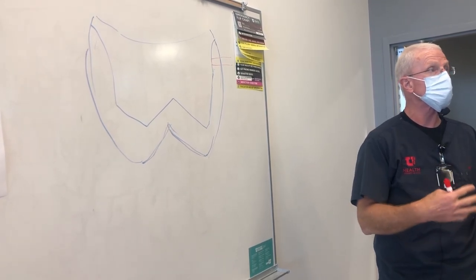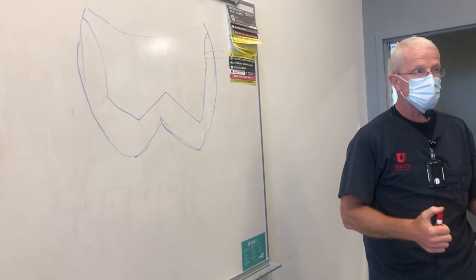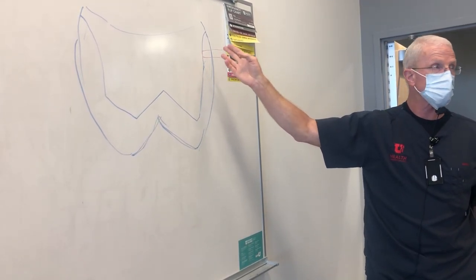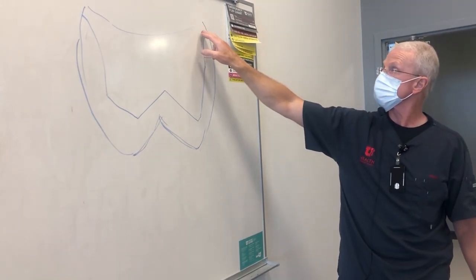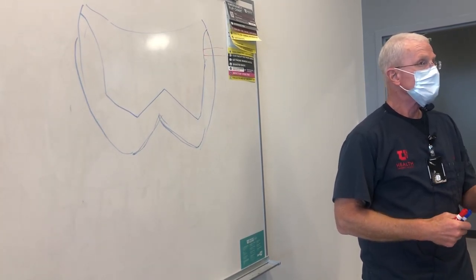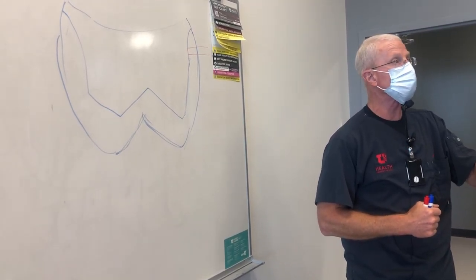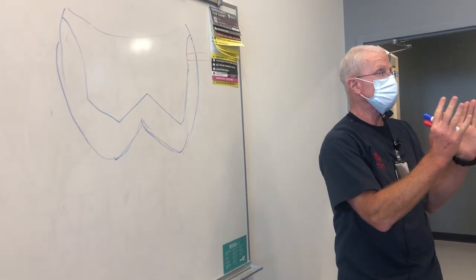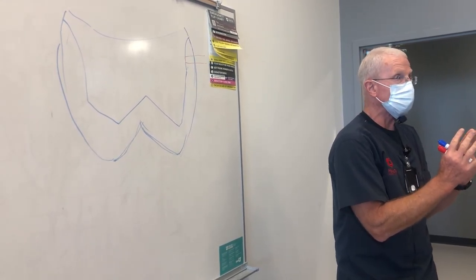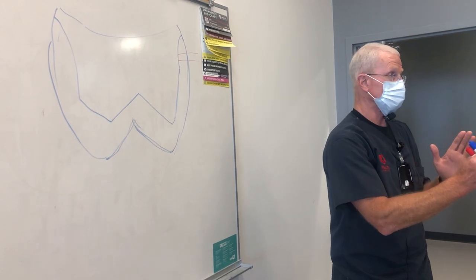And you need to get good with looking at shapes and having an idea. Is that about a half millimeter? Is that about a millimeter? Because the criteria on this preparation are what is the target depth on your chamfer margin. It's 1 millimeter, isn't it? And so on the assessment form, we give you 0.75 to 1.25. It's a half millimeter range, which is pretty broad. We just want you to fall in that range where it's about 0.75 millimeter up to maybe 1.25 millimeter. So we want you to aim for 1 millimeter.